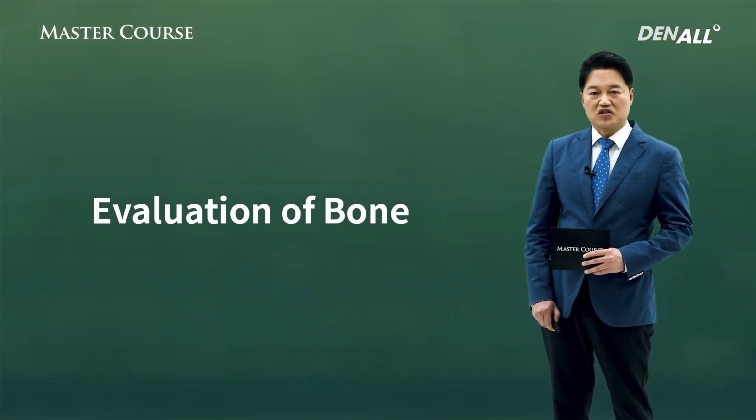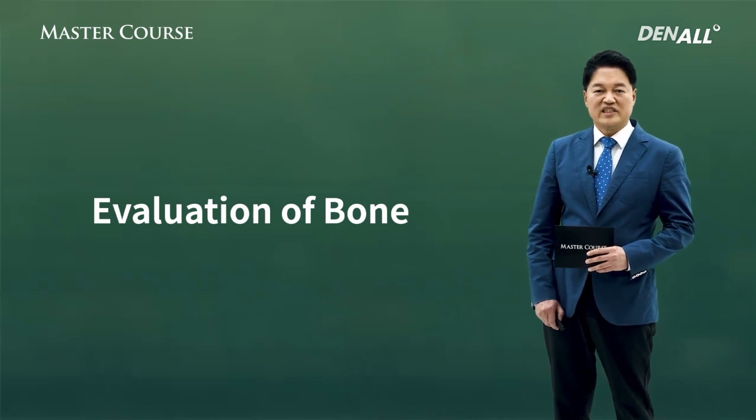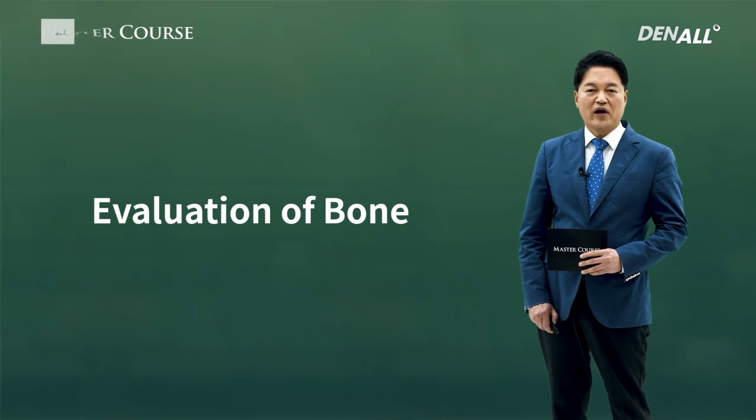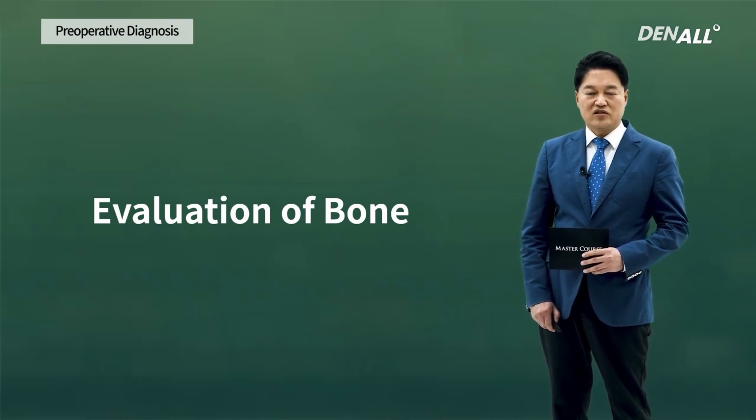Up until now, based on the information gathered through radiographic image and CT, we need to evaluate the bone where the implant is going to be placed. Evaluation of bone can be divided into bone quantity and bone quality, and I'm going to talk about bone quantity.